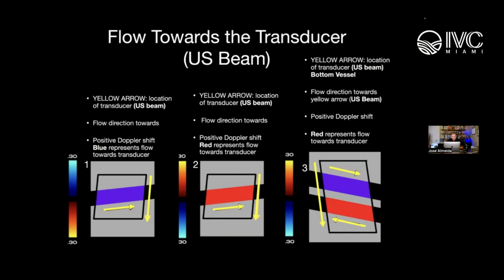And then you can assign, as you steer the probe, if I want the artery to be red and the vein to be blue, or reflux in a vein to be red, you can set that up yourself based on the way you're turning the transducer and the orientation of the vein. So you're steering parallel to the way the blood vessel lies. Is that correct? Or maybe you can explain that a little clearer.